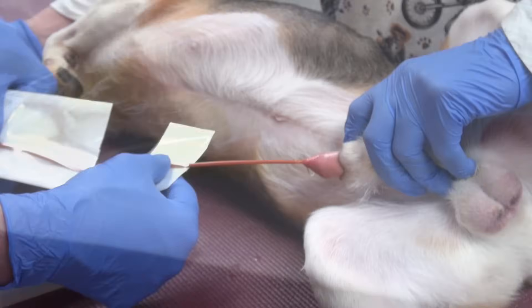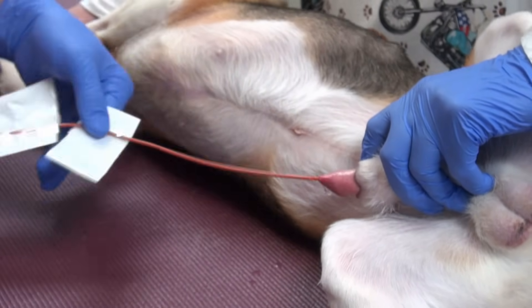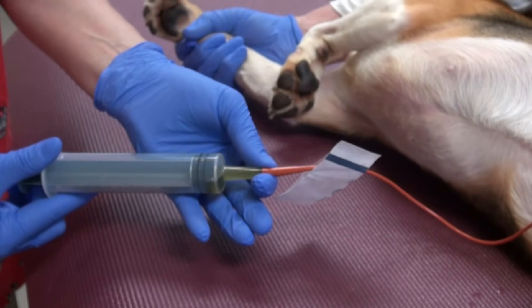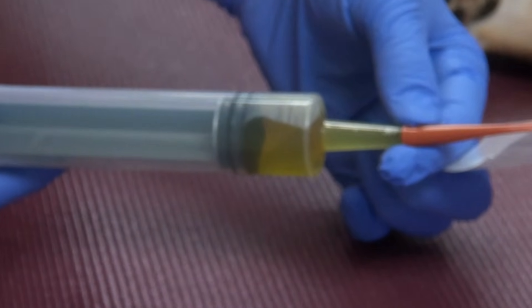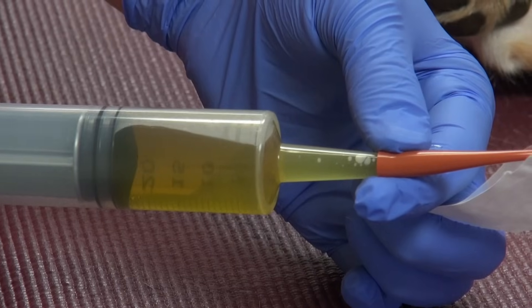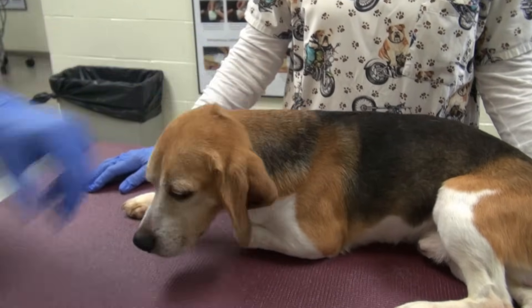At this point, you may hold the catheter stationary and remove the outer wrap, then attach the catheter tip syringe to the catheter. Aspirate some urine to confirm that it flows freely. If your dog's bladder is very full, remove a full syringe worth to partially empty it and dispose of the urine in the sink. Once the procedure is complete, the catheter is gently withdrawn. If your dog is awake, be sure to give him a treat.